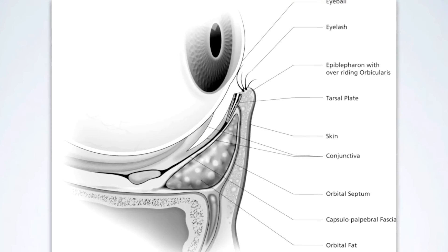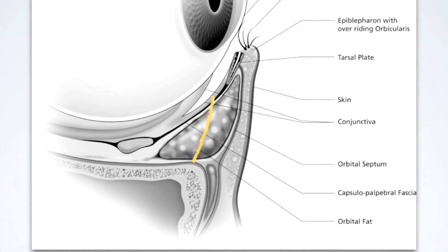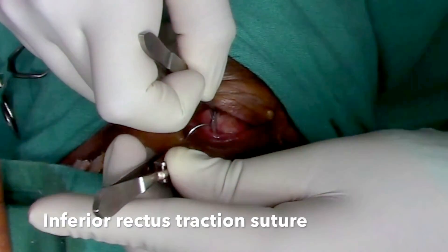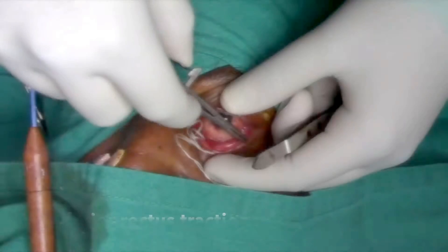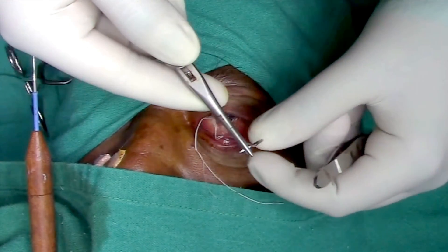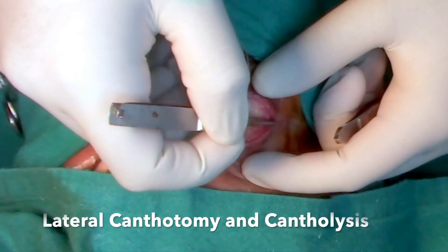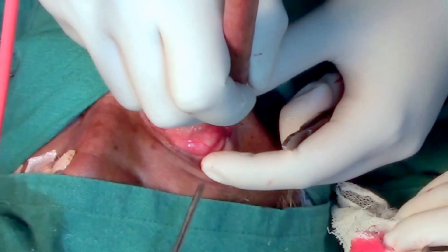The incision is made just below the lower edge of the tarsus and extends to the orbitotomy inferiorly. My first step is to take an inferior rectus traction suture, which can be taken with any suture material readily available; this helps in moving the globe up and down during surgery. The next step I prefer, which increases surgical access, is a lateral canthotomy and cantholysis. A spring scissor can be used, and the cantholysis can be augmented using radiofrequency coagulation.